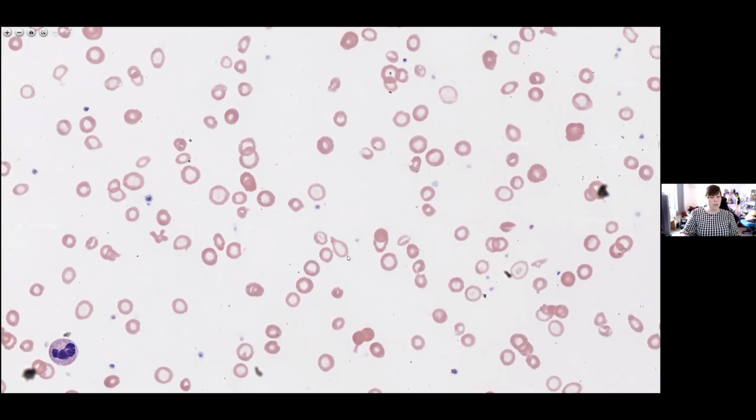But in my experience, you often see these in disorders that are affecting a patient's bone marrow. Now, that can be a number of different causes, but they do think that these type of cells might be formed when they're actually squeezing out of the bone marrow spaces. That could be due to increased destruction in the bone marrow or increased turnover, increased production of cells, and they're trying to get them out early, they're pushing them out early, and they're actually getting a little bit squashed as they come out. Now with teardrops, it's important to remember that they can occasionally happen as a smearing artifact.